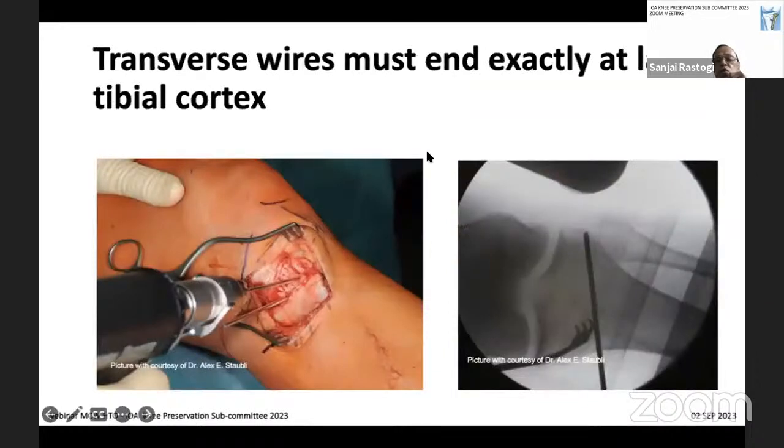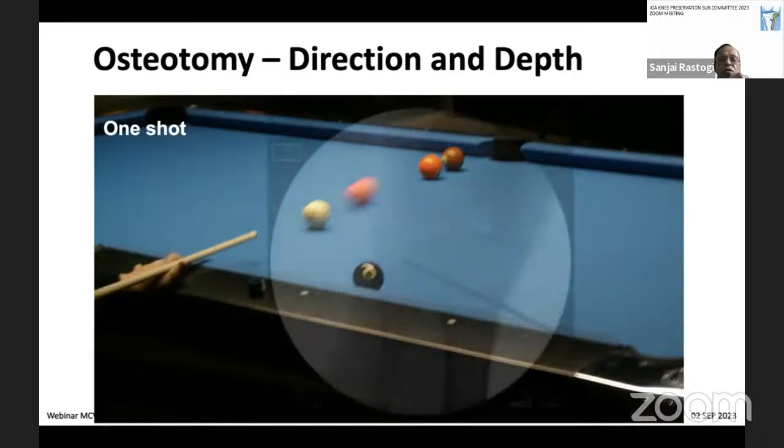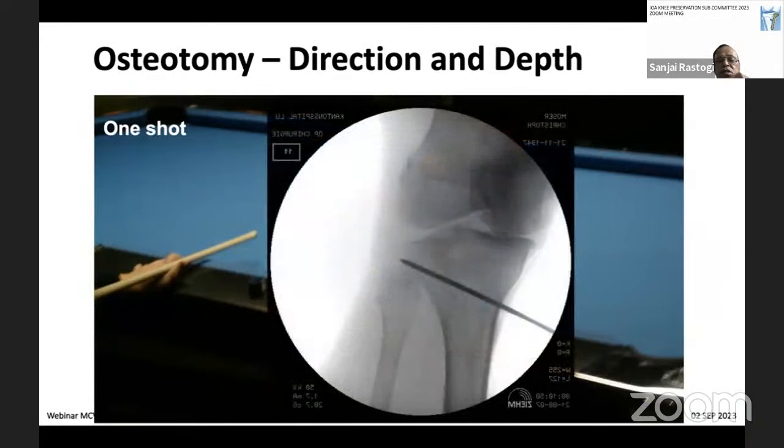The wires must go right up to the end in the lateral cortex, which should be seen in 30 degree internal rotation, and the osteotomy should be done in one shot to avoid damage to the structures and vascularity of the bone and soft tissue. This is in 30 degree internal rotation.